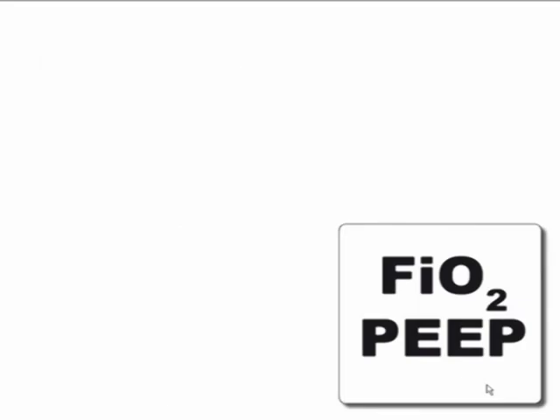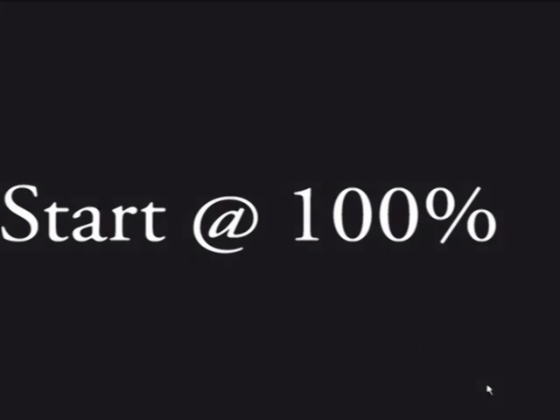All right, we're now down to the last dial. And I stick two things on this dial because really they should be moving in tandem. I've actually seen a ventilator that has FiO2 and PEEP combined into one dial, which I don't necessarily agree with in real life, but the concept is good. All right, here's the way I play it. I start these patients at 100% FiO2 right after intubation. You make up for any hypoxia you caused during the intubation. I wait 5 minutes to let everything equilibrate.